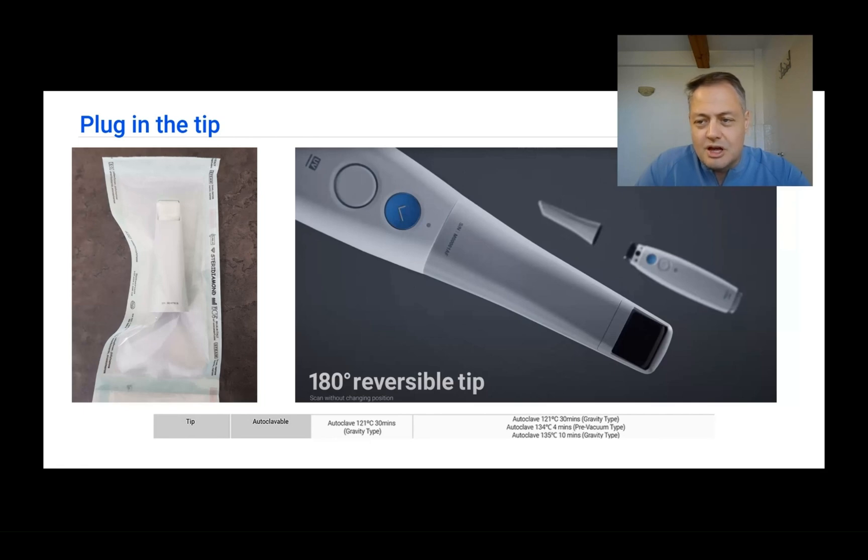Remember this because it helps when scanning the upper or lower arch. When you receive tips, the first thing you do is sterilize them before using them on patients. I use the proper solutions described by Medit. After wiping the tips clean, I dry them with sterile gauze and place a sterile pellet inside the tip after wiping the mirror clean, because stains from sterilization pouches can induce errors or stop the scanning process.